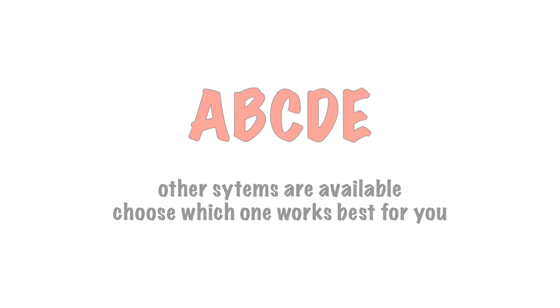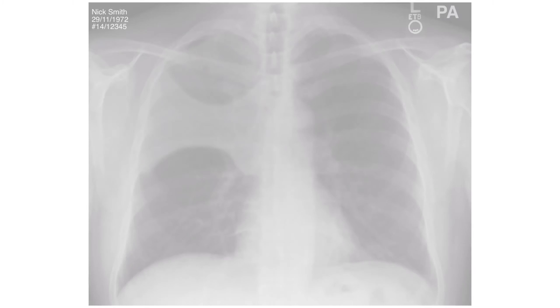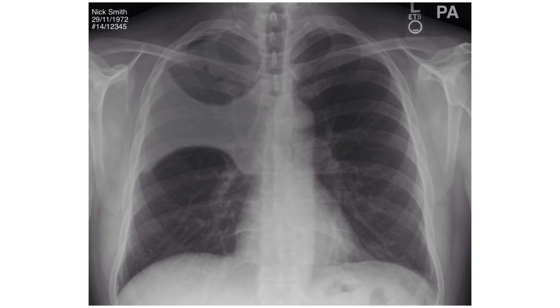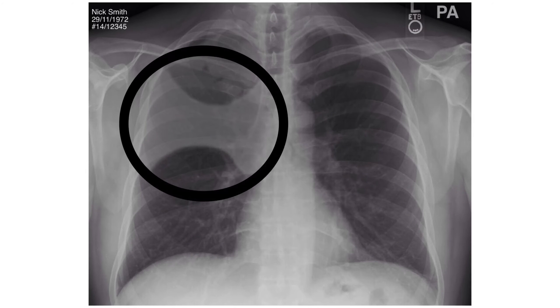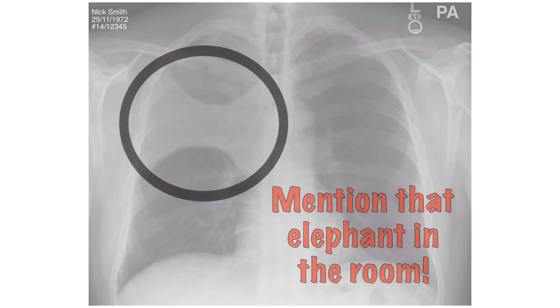We'll be using the ABCDE approach to chest x-ray interpretation. If there is a clear area of abnormality, don't hesitate to highlight it first. But remember to go through systematically afterwards to check you haven't missed anything.